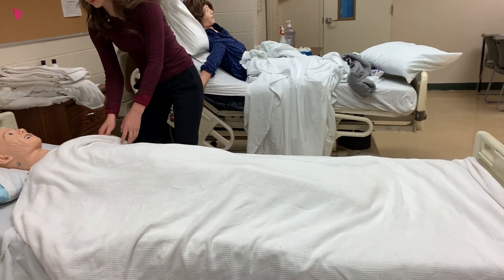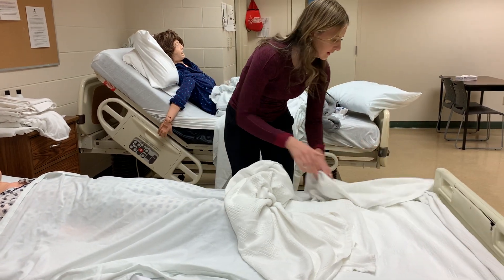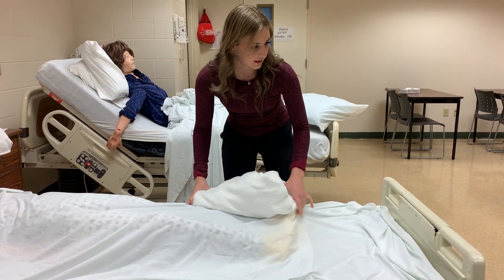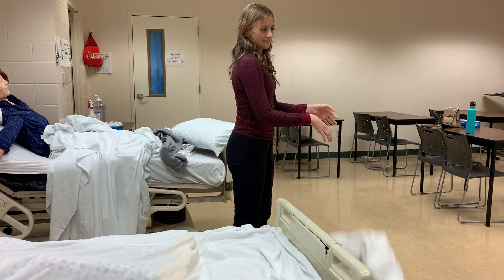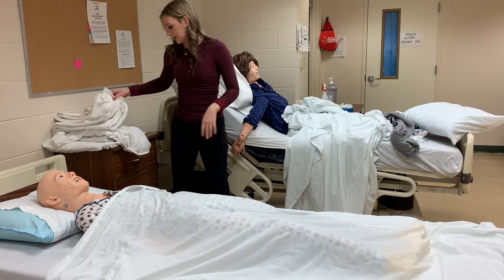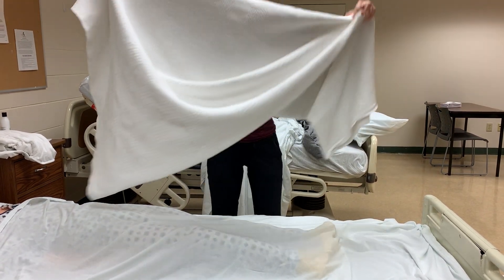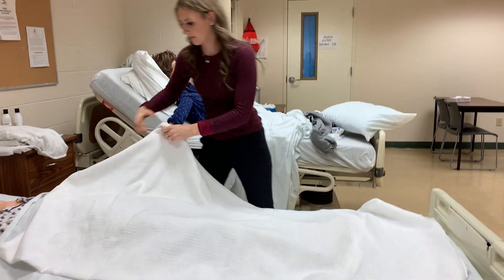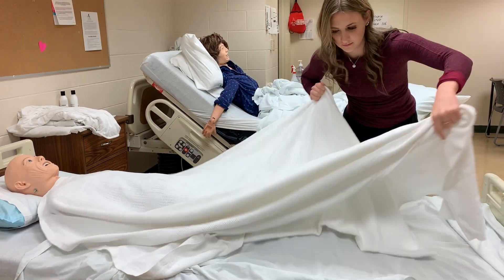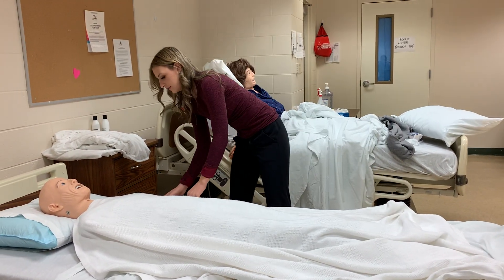I would then start by loosening the linens at the bottom of the bed. Then I would pull back the first top sheet, making sure all of it gets brought in on itself, and place it in my dirty hamper. Then I would take my bath blanket and place it over the top of the patient so that they're completely covered.